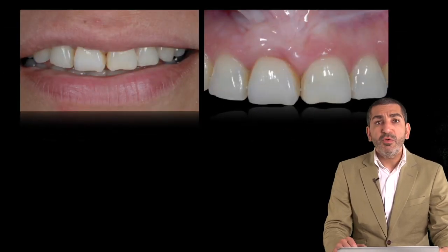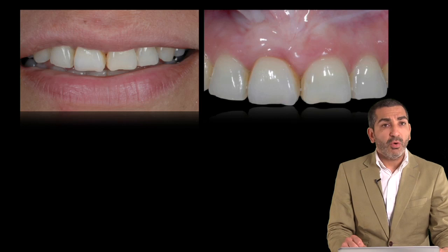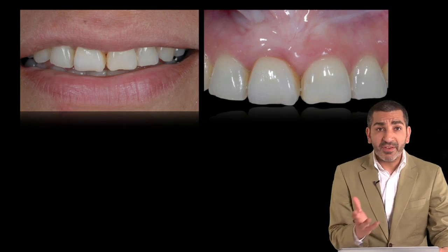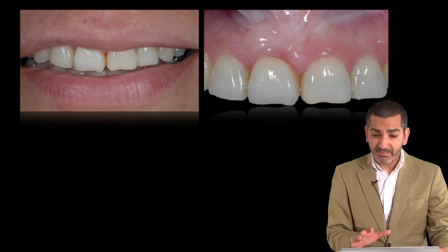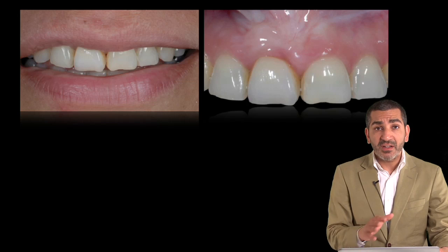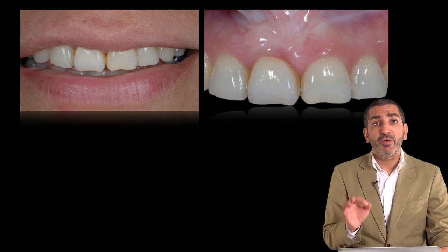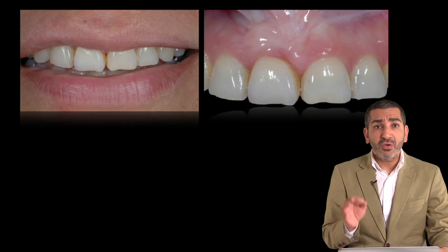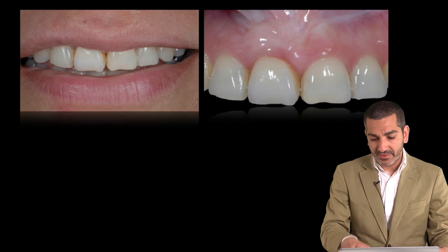And then we move on and we show you the final restorations. You can see that although we use a particular type of material as an abutment, I'm not going to tell you which one yet, we managed to basically avoid the fact that it is showing through underneath. It is basically irrelevant. And that's because our tissues are of a particular thickness. And as long as they're thick, we're okay, we can get away with any kind of abutment.